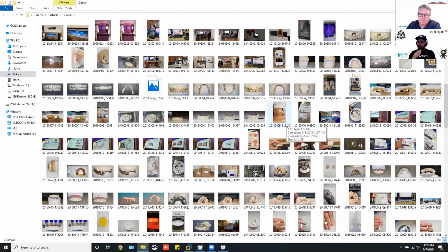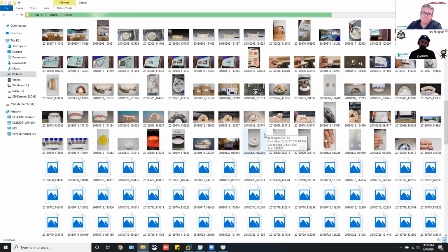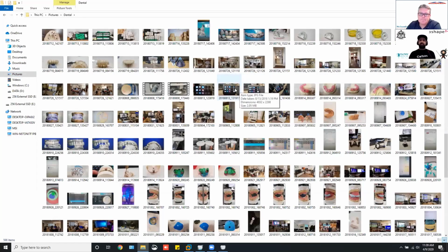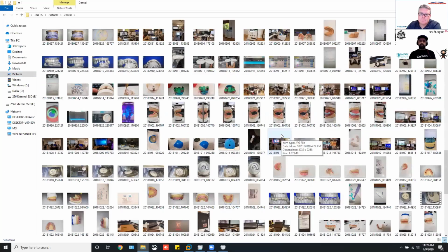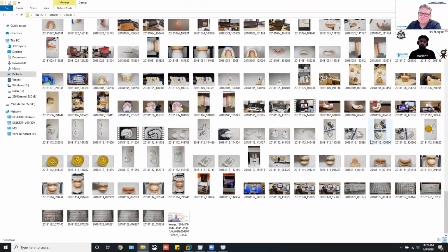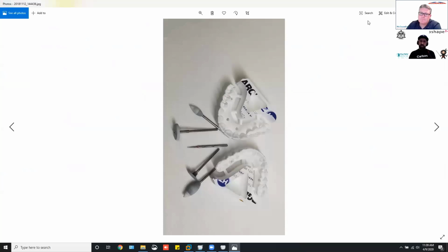The other thing is, I'm trying to find it while we're looking at it, Wagner. Wagner's got a really good line of tools. They even have a zirconia green state finishing kit that you can buy and use to finish your zirconia down. Crowns, I really just smooth the sprues down, and that's pretty much it.